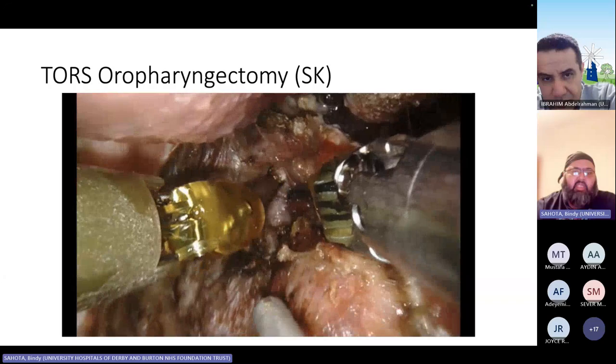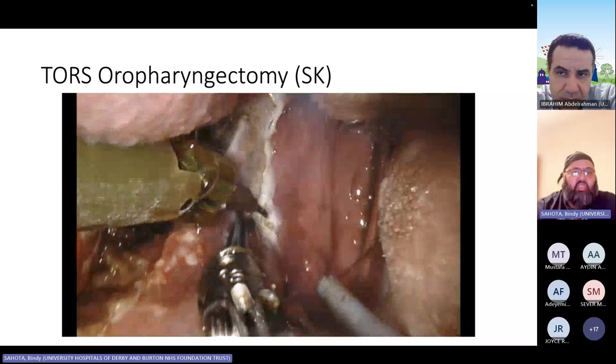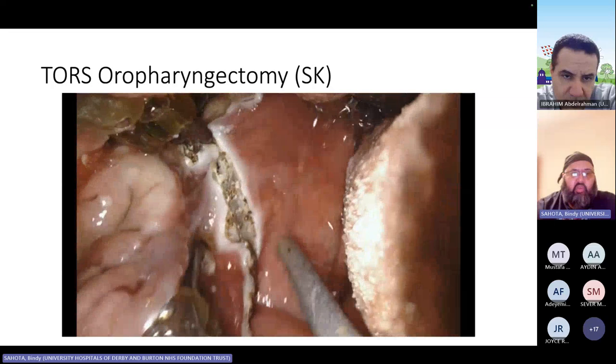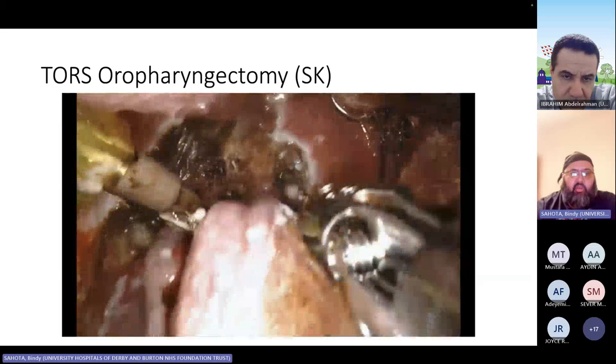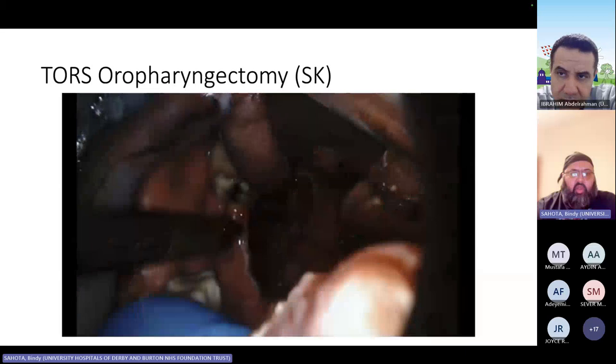The hardest thing when you start a robotics program is getting the head of the pathologist around the actual specimens that you're taking out, because these always shrivel up. So you can see here, that's the posterior pharyngeal wall being cut. I'll often do that cut slightly earlier, just so I know where I'm going to end up. And then you roll everything out. When you're rolling it out, I often bring the camera back. You reorientate it exactly how you found it. And then we pin it on a cork board ourselves, is normally what we do as a whole.